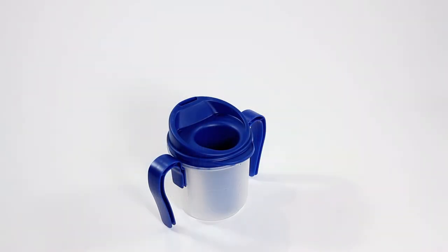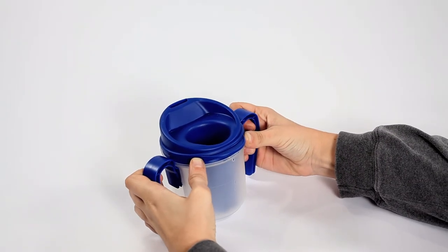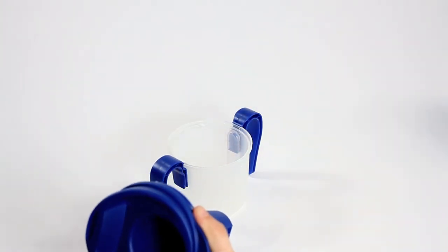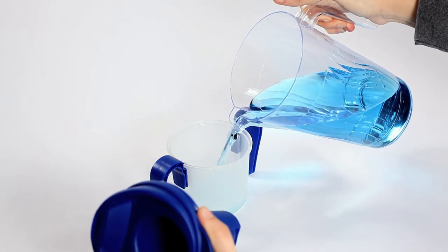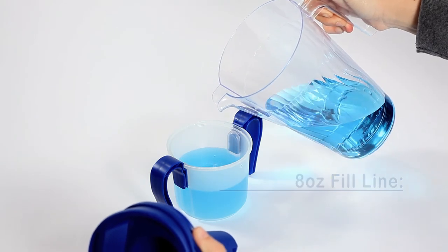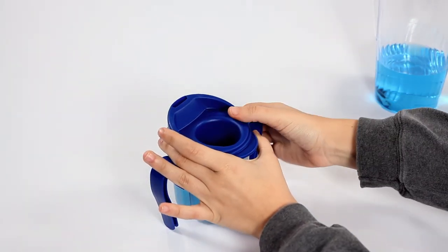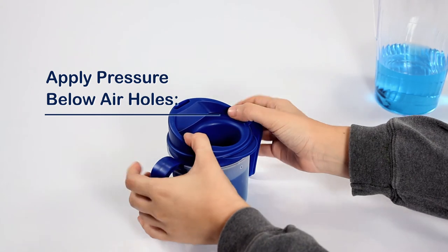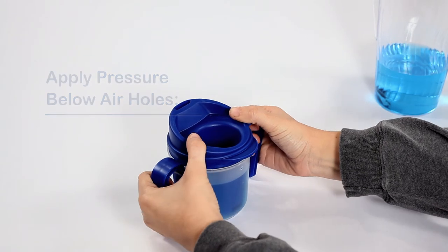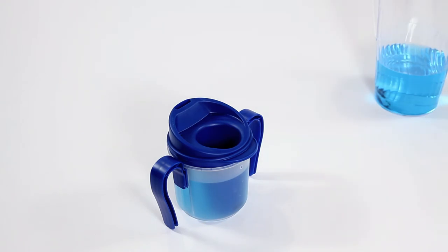To refill the ProVail Cup, disassemble it by placing it on a firm, flat, clean surface, grasping the tab on the cup lid and lifting up. The cup lid and mid-cup assembly should separate from the outer cup. Fill the outer cup up to or below the eight-ounce fill line located on the inside of the outer cup. With the outer cup on a firm, flat surface, orient the cup lid and mid-cup assembly into the outer cup. With your thumbs positioned on the raised rim near the two holes in the cup lid, apply downward pressure and snap the cup lid and mid-cup assembly into the outer cup. When assembled correctly, an audible snap will be heard.